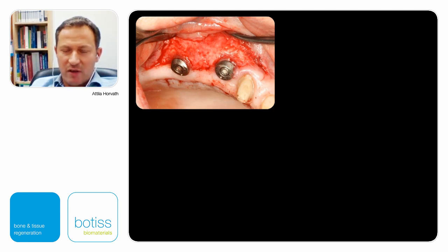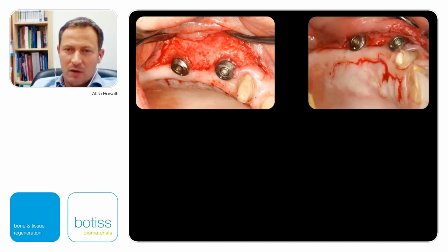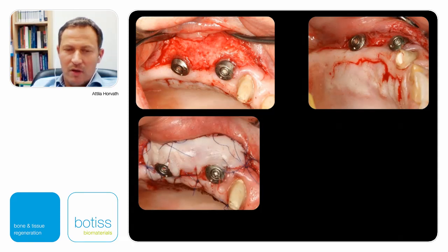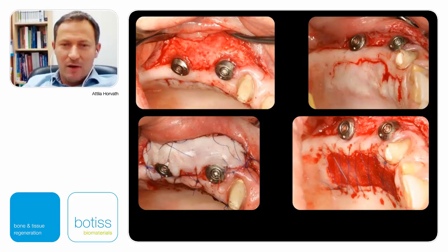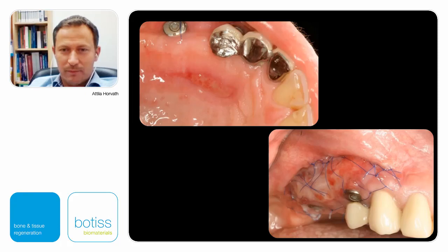We tried to reconstruct this width and band of keratinized tissue. Again, we took a nice band of ECTG, epithelial connective tissue graft, and transplanted it from the palate to buccally. It's a huge chunk, of course, but when we have implants already, it's a good start to reconstruct this tissue. Of course, the morbidity is a little bit high in that patient, so in that situation, I was very happy to stay on the blunt end of the scalpel and not the sharp one.